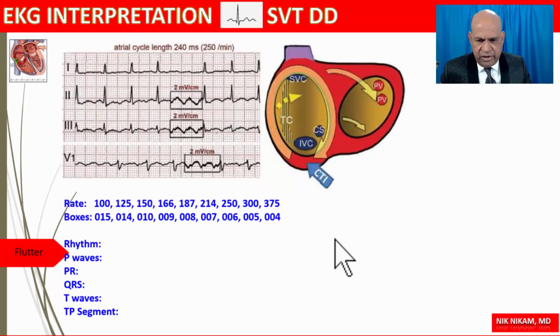So let's look at another example, and this is the second type of atrial flutter, namely type B, where the impulse is going now in the clockwise direction through these accessory pathways located in the right atrial side of the atrial septum. And these P waves are supposed to be peaking upwards. I mean, that is, if you can imagine that, but when you see a sine wave, I don't know which one you call up, which one is down, but nonetheless, this is type B atrial flutter.